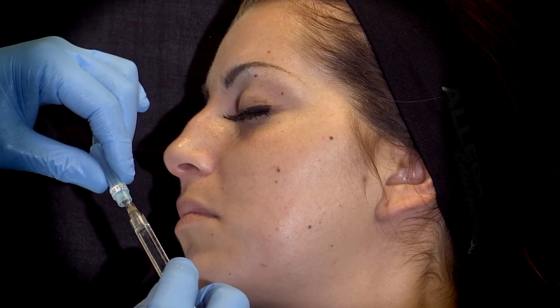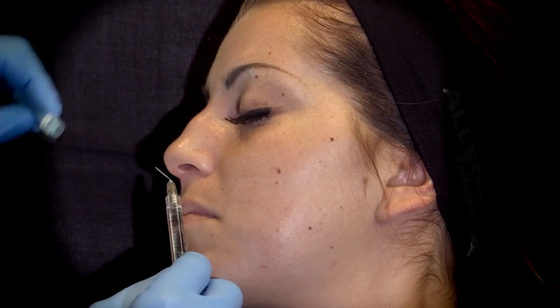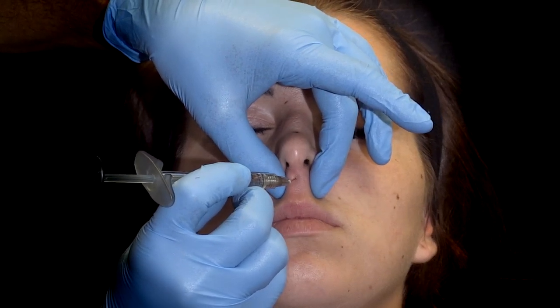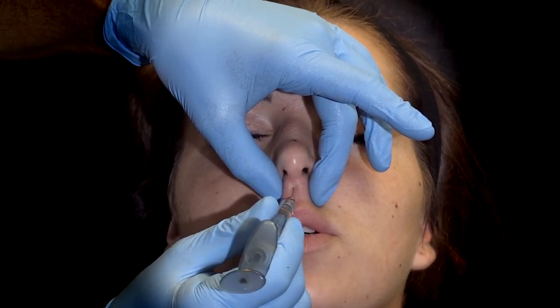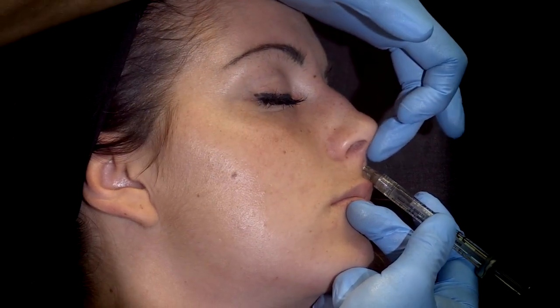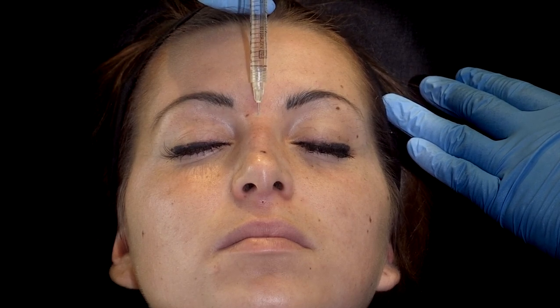Then, with the same entry point, we bend the needle on the sterile cup and we inject on the columella to create something like a cartilage graft with this volumizer HA gel. As the injection is medial, it's safe, and we obtain a good tip support and a tip rotation.